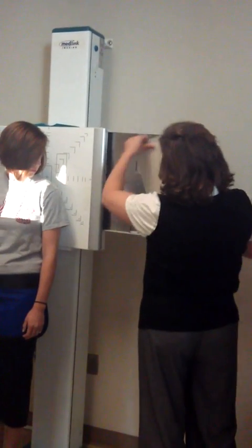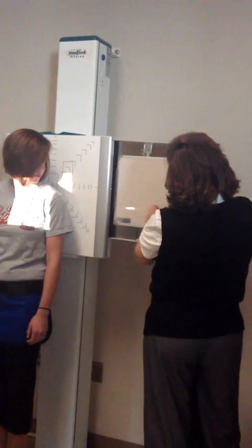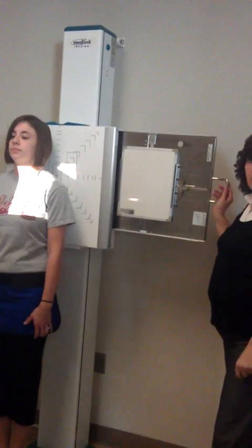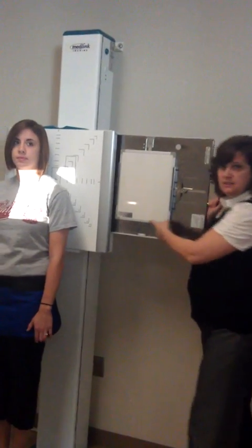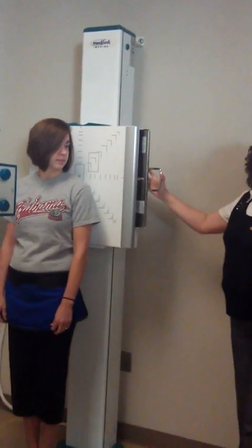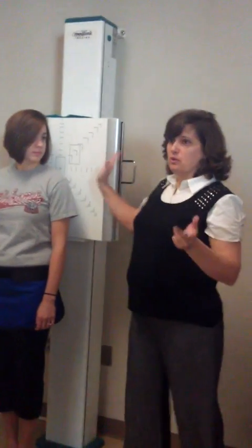So that when we turn our cassette it's in the middle. You will have to move this from 10 to 12, or 12 to 10 — whichever one you do first. I don't care which one it is. It has to be moved.